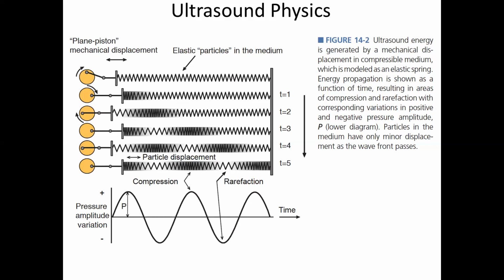But we'll see when we go to some advanced topics that what actually happens, interestingly, is that depending on the peak pressure, the speed of the wave is different at different peak pressures, right? And so the wave itself starts to distort because it's not a perfectly linear process.